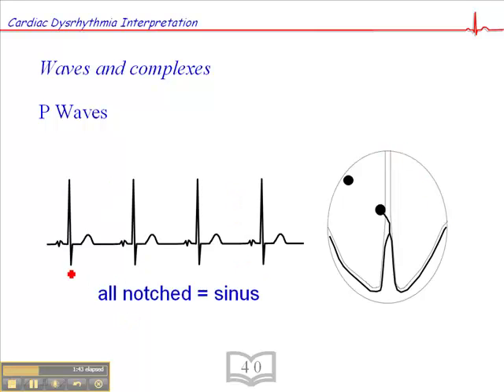So here's an example. So here we have notched P-Waves preceding each QRS, and they're all identical. The rhythm is regular, so the P-Wave morphology is unchanged. When you see this, it represents a sinus rhythm, and it simply means there's probably underlying atrial hypertrophy.